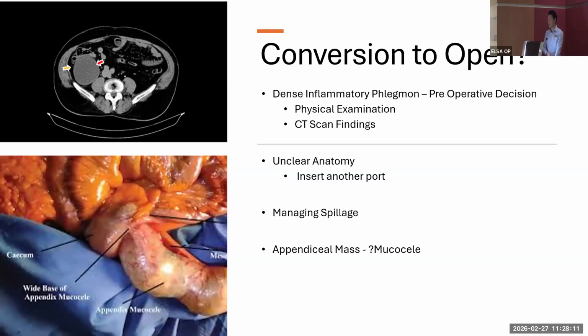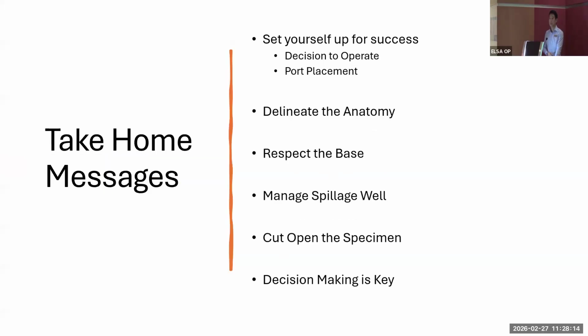Take-home messages, okay, is always to set yourself up for success. It starts with a decision to operate or not to operate, how you place your ports, how you delineate the anatomy, how you respect the base of the appendix, the stump of the appendix, how to manage spillage.